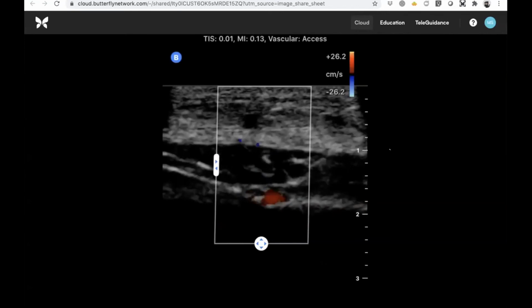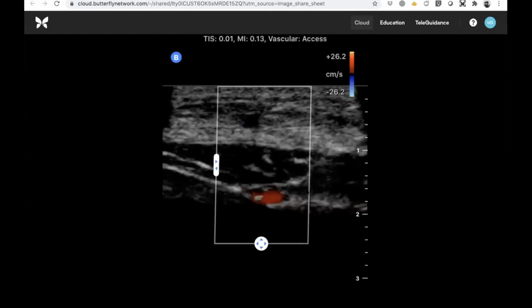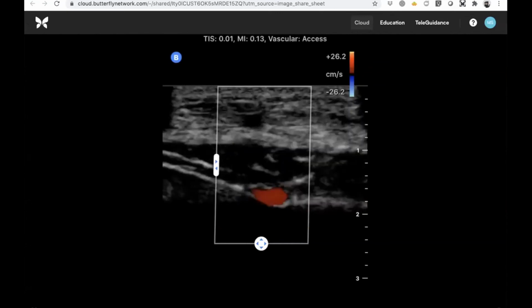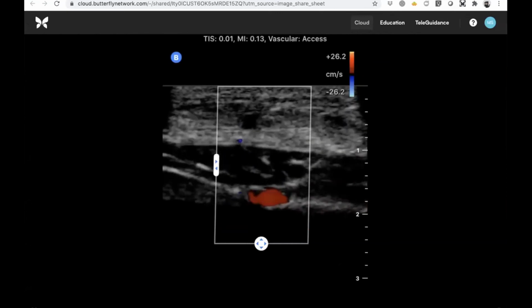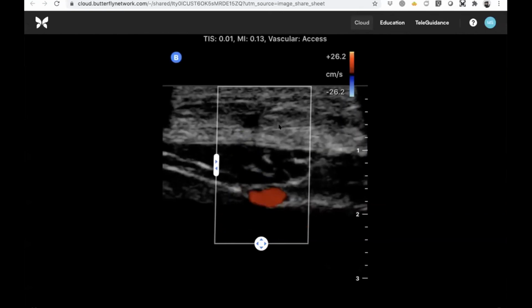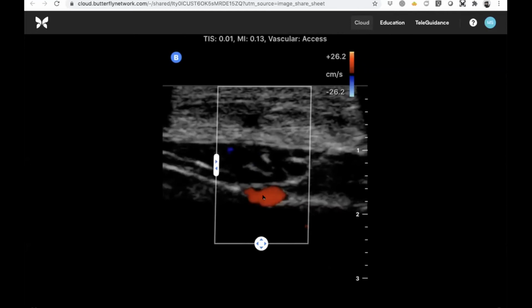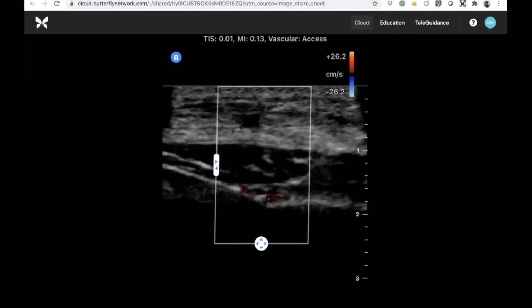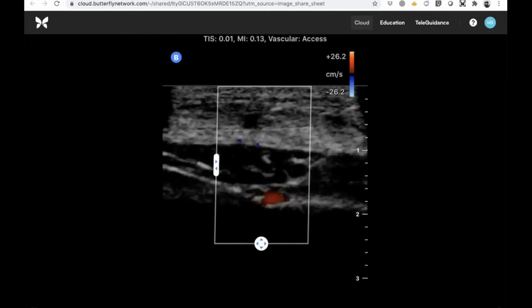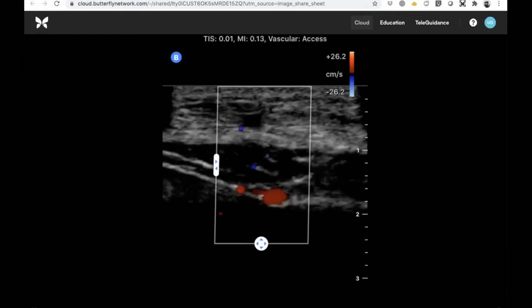But this is a pre-paracentesis color flow image of the lower quadrant of the abdomen. I don't know if it's the right lower or left lower quadrant. So Brian, if you're still on labeling, just throw in a label and that'll tell us. But we've got skin and soft tissue here, muscle belly, and this color flow here, which are the inferior epigastric vessels. And just below that, it's all anechoic. That's because this is the ascites fluid that they're getting ready to go after with the paracentesis.